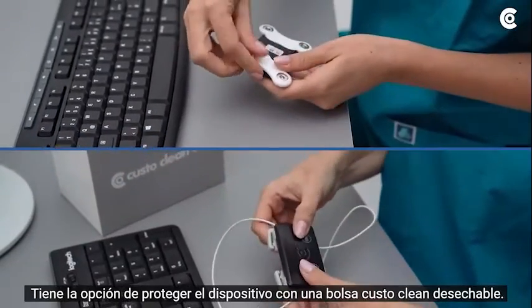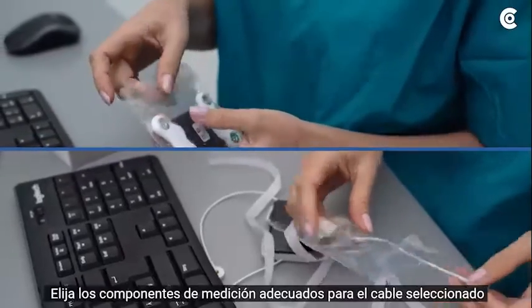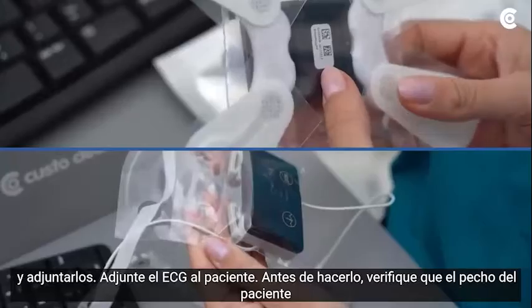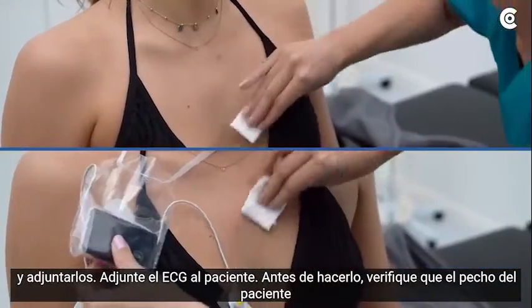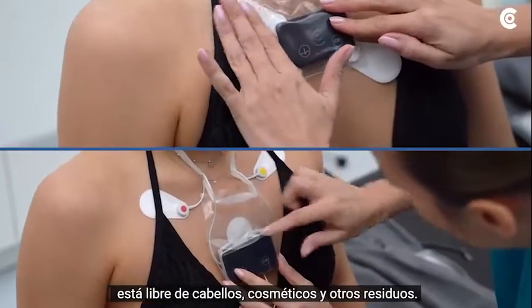You have the option to protect the device with a disposable CustoClean bag. Choose the appropriate measurement components for the selected lead and attach them. Attach the ECG to the patient. Before doing so, verify that the patient's chest is free of hair or cosmetic and other residues.